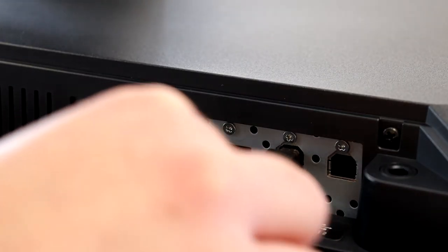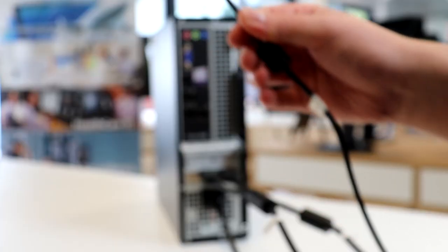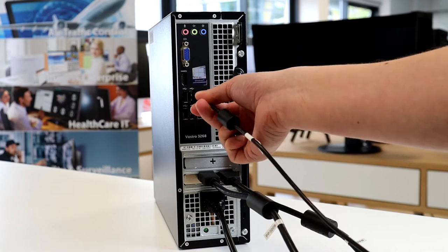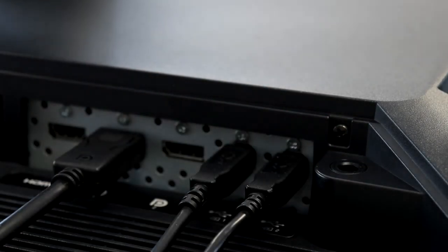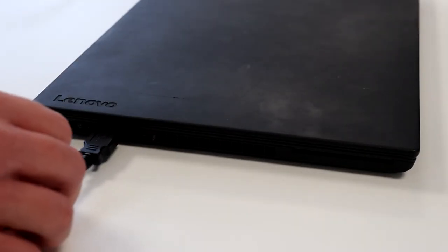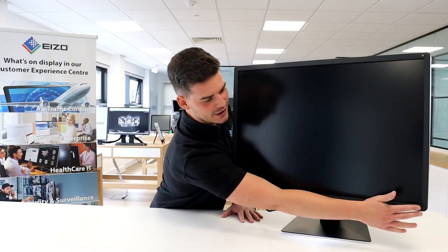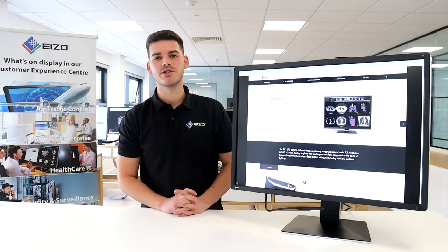Last but not least, connect the type B end of the USB cable into the monitor's USB upstream port 1, and then the type A end of the cable into your workstation. If you're utilising the monitor's KVM switch then a second USB cable will be required. With everything in place, go ahead, turn the front power button on, and you should finally see your image.